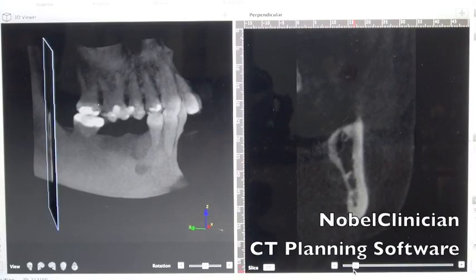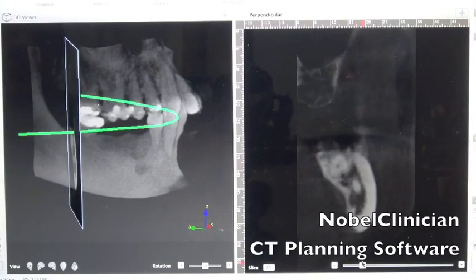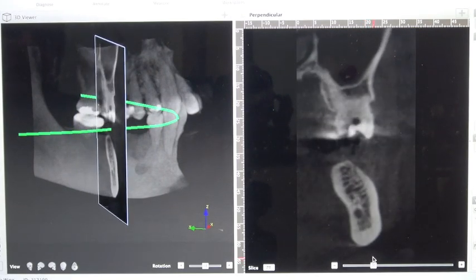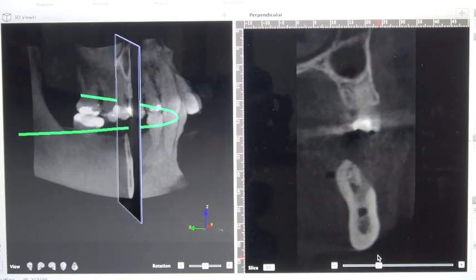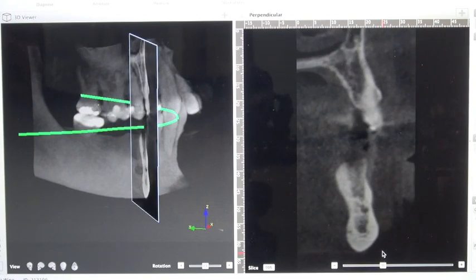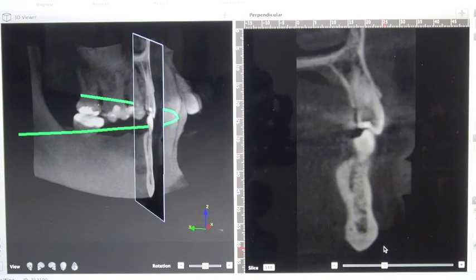If we look at the CT scan with Novel Clinician, we can see that the ridge is getting fairly narrow here. This was right after she had the tooth taken out, so you can see in the anterior area that the ridge is actually quite a bit missing.